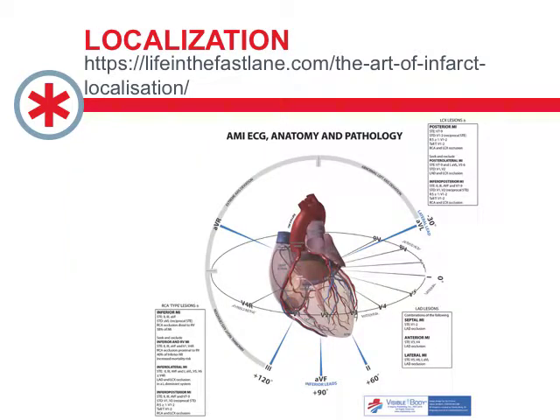And so I think these sort of ECG changes are probably pretty much a review for most of us. But sometimes the localization is a little tricky. And I really highly recommend you poach this picture, put it on your iPhone or device. The link for it is at the top.